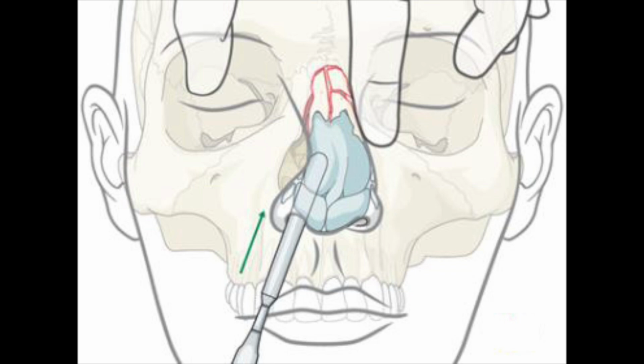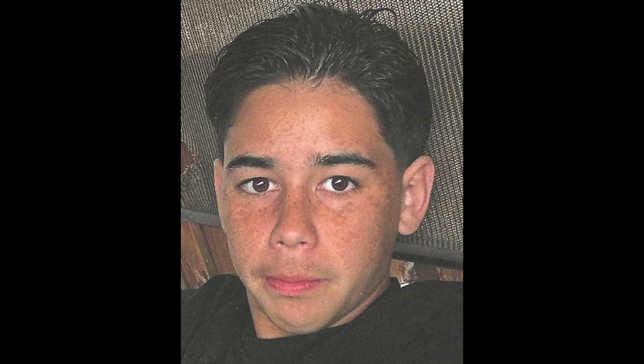I like to do this in the operating room because sometimes these patients can have some significant nose bleeding with the procedure, and it's nice to have their airway controlled just so they don't aspirate any blood or anything like that. And so now we can look at some results from his procedure, and this is him preoperatively and pre-injury.